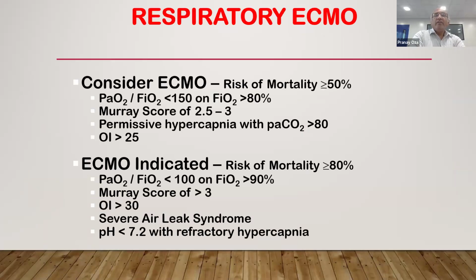Always consider ECMO at the stage where the mortality is more than 50%. By the time ECMO is initiated, it will probably be at a stage where mortality is 80%. The reason for thinking about ECMO early is that it takes time for everything to be organized.